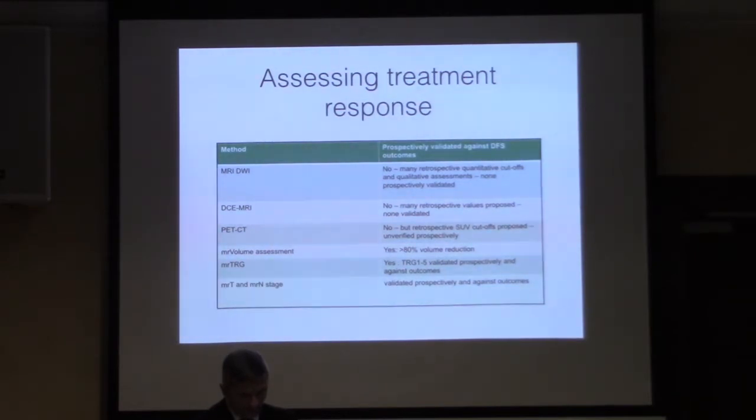How can we improve that? Well, you can start to use treatment response grading, so TRG scoring. Finally, T and N staging is also validated as well. So our T2 assessment and volume of tumour are the things which are reliable in assessing tumour response.